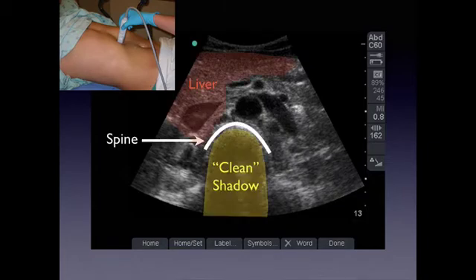So I just want to show you a lot of images so you're able to kind of get in your mind where everything is. And the good thing about us doing these voiceovers is that these lectures will be available to you at all times. So that'll be nice because then you can go back and review them. And, you know, it's not like you've only seen it one time and then don't have access to it.